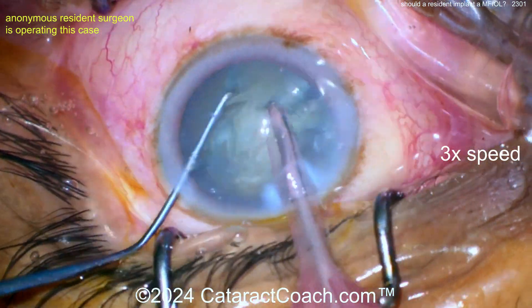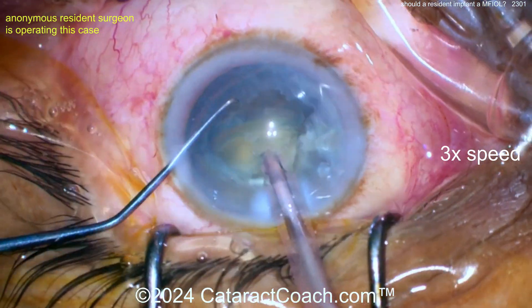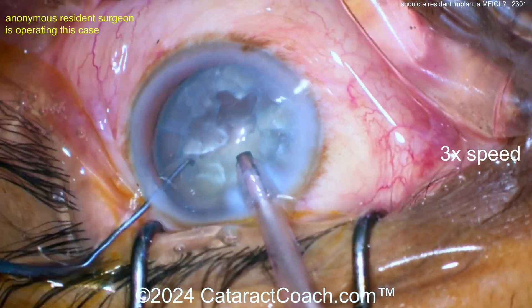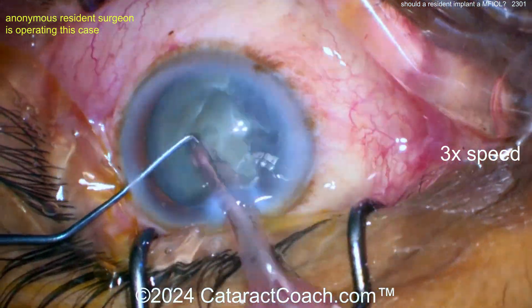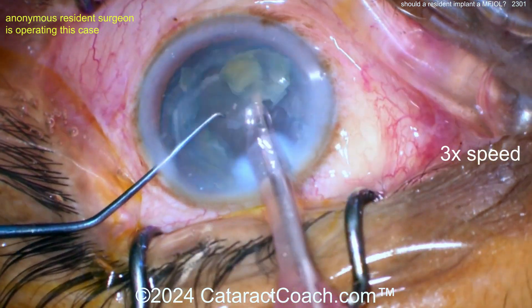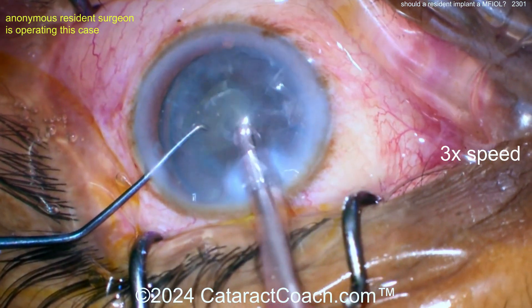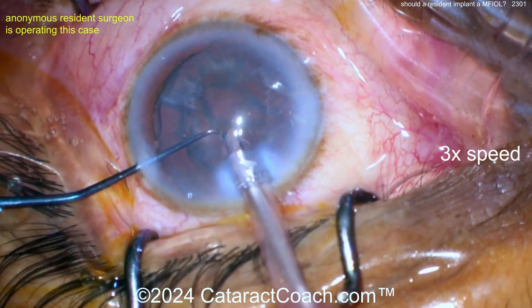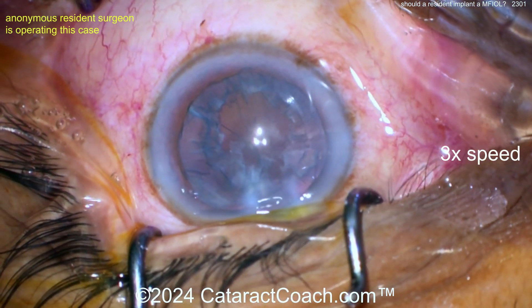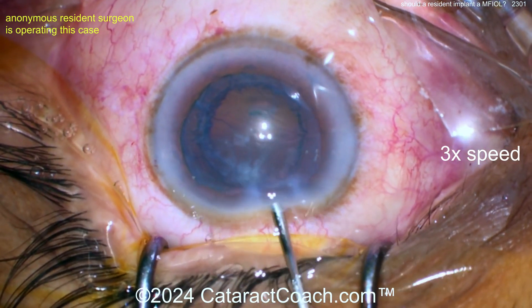Is this really a resident case? Usually if you've done less than 50 cases, there's an attending involved — a professor sitting next to you scrubbed in — and at a minimum they're squirting in the cornea, and I'm not really seeing that. Regardless, getting the nucleus out you're doing a reasonable job. I wish the eye was in primary position a little better. Take your time — the cataract's not going anywhere. That's pretty good. Now here comes the epinuclear shell.